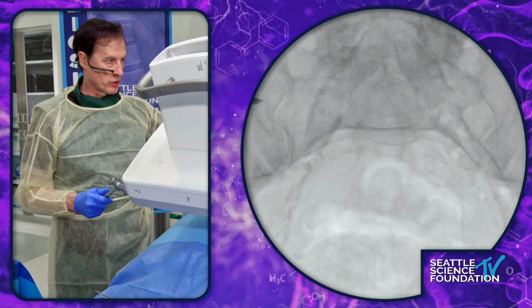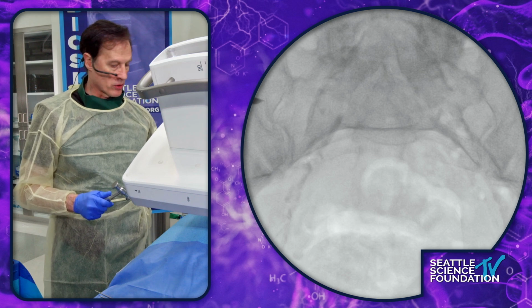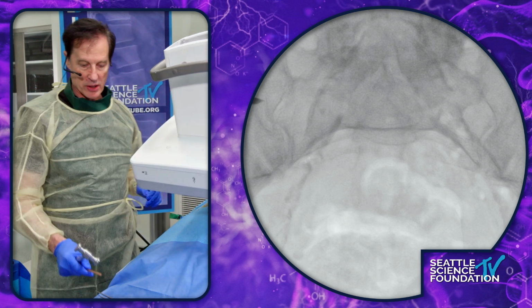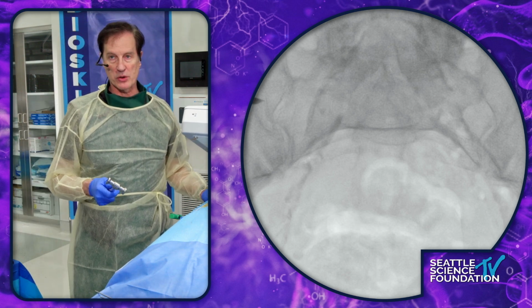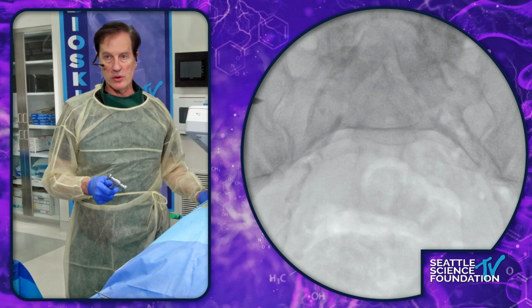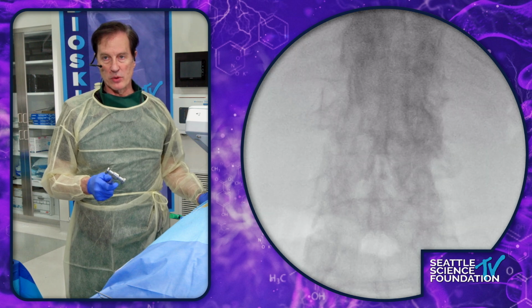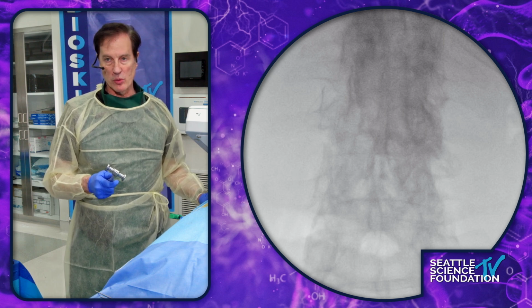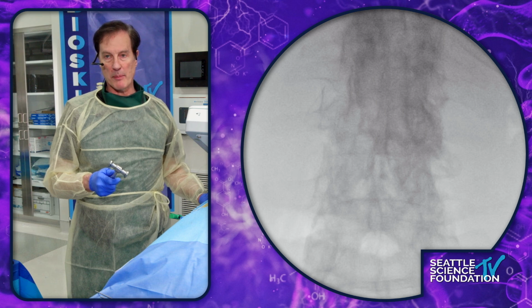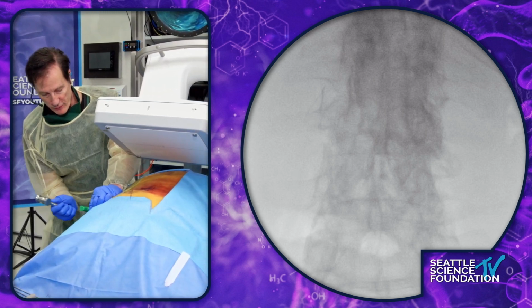So we'll go from there to the pelvic outlet view, and we're going to place the implant on the pelvic outlet view. So we're right in the middle. We're not too far anterior. We're not too far posterior. As you can see, you have a nice swath of territory, a large amount of territory that you have to go through. And remember, the vestigial disc was the marker of the S1 neural foramina and the S1 nerve root coming out. So we're right halfway between the top part of the sacrum and the S1 neural foramen.